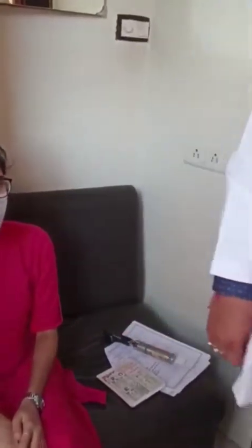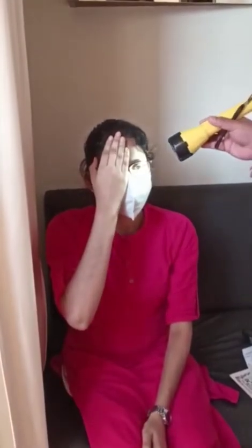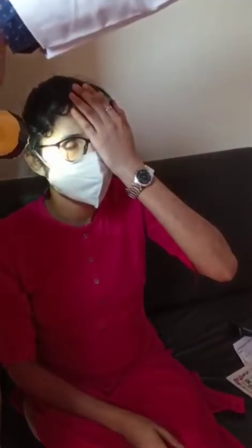Now we will check your clear vision. Can you close your right eye? Now read that. Is it readable? Okay, close the other eye.